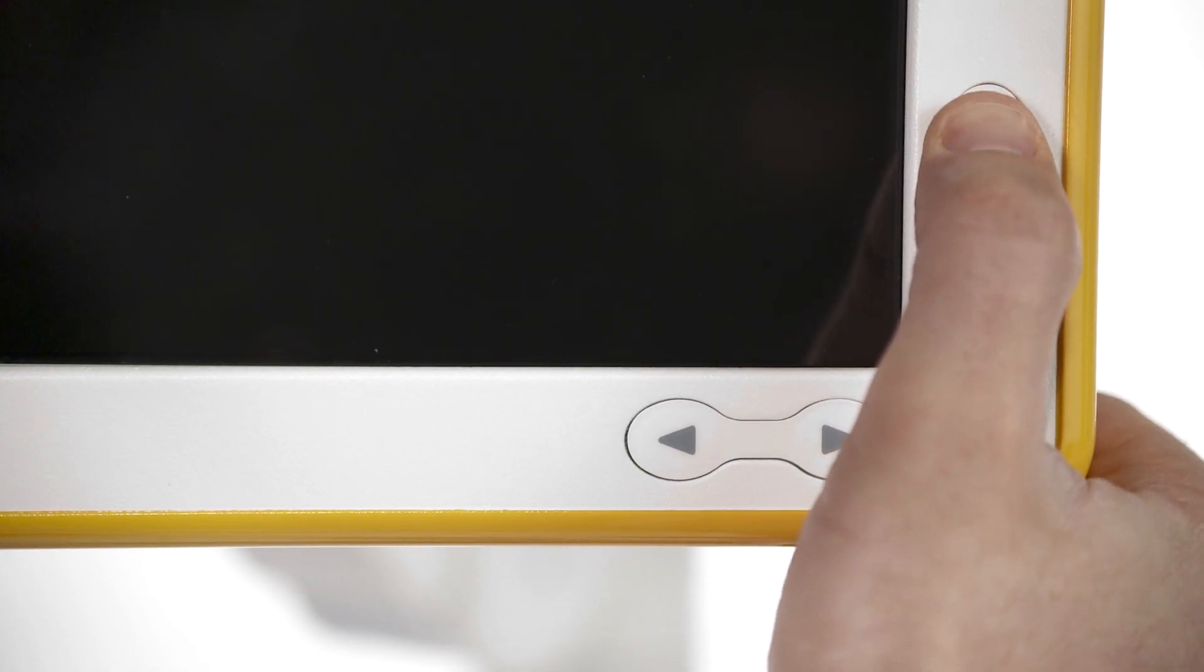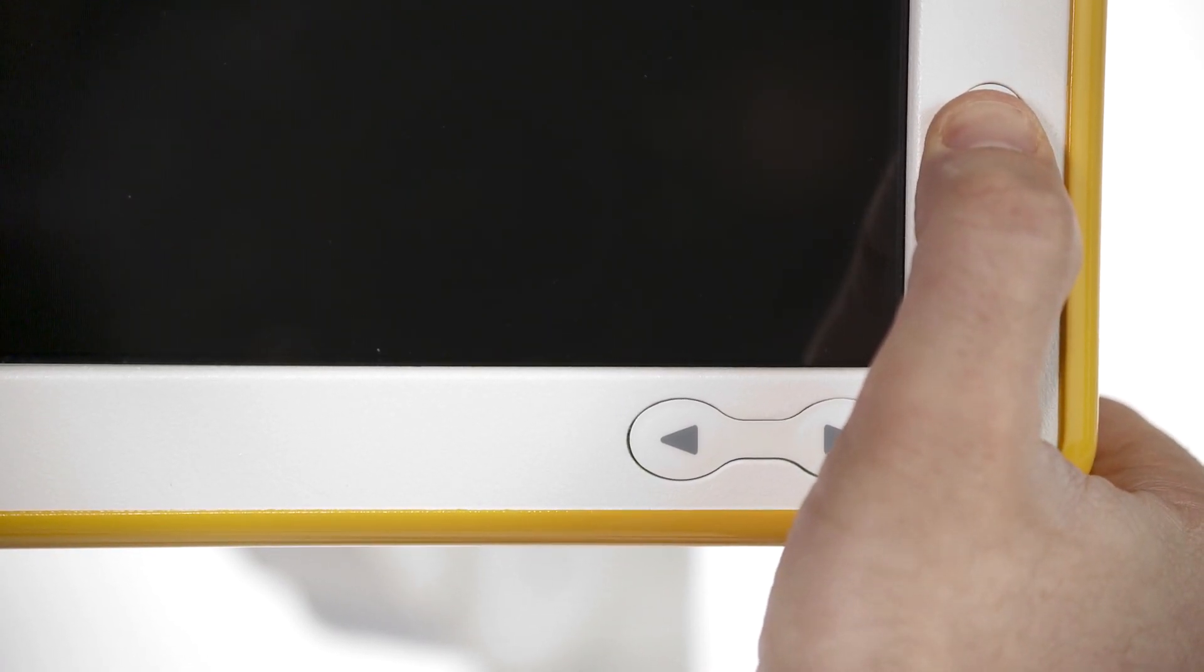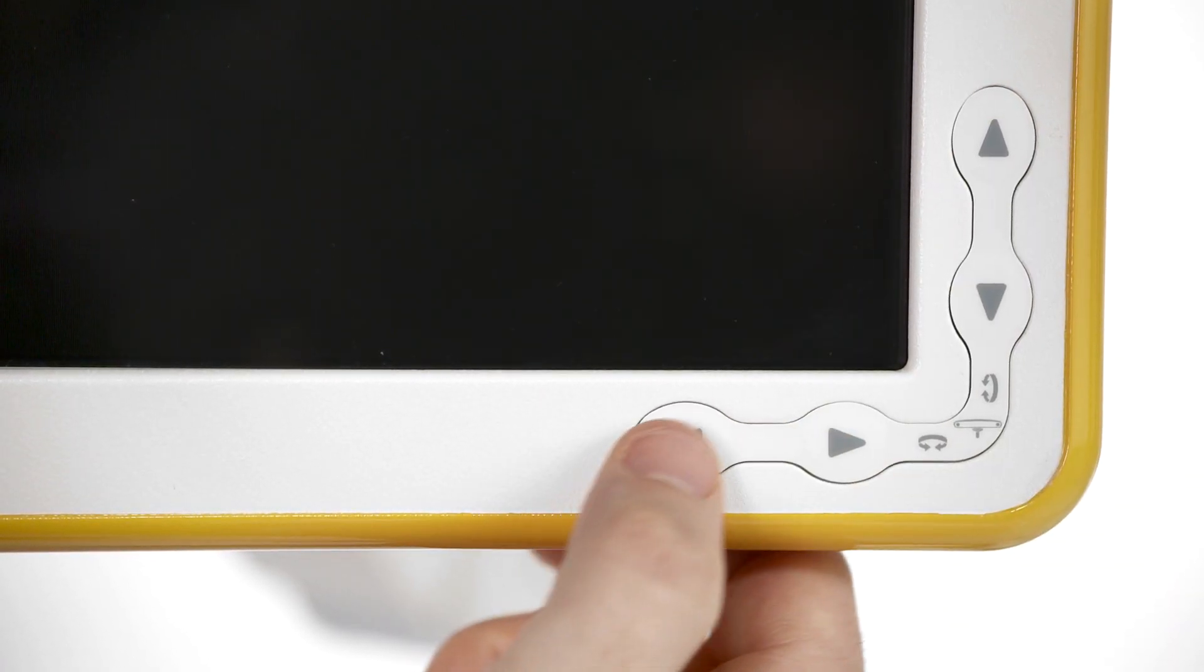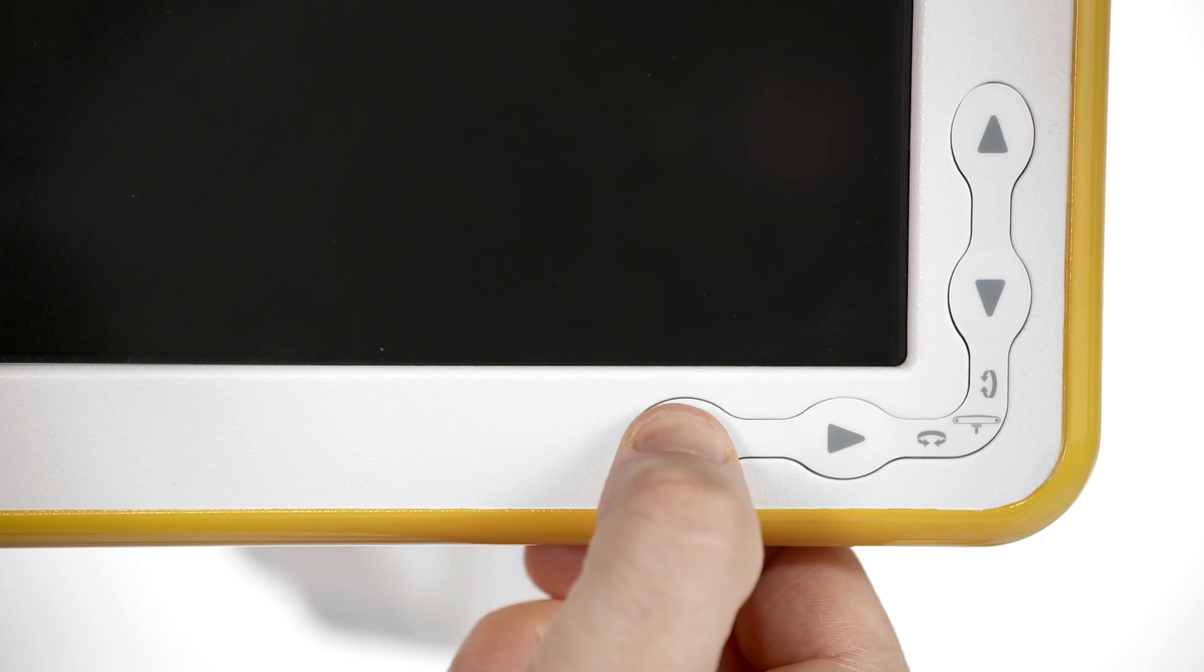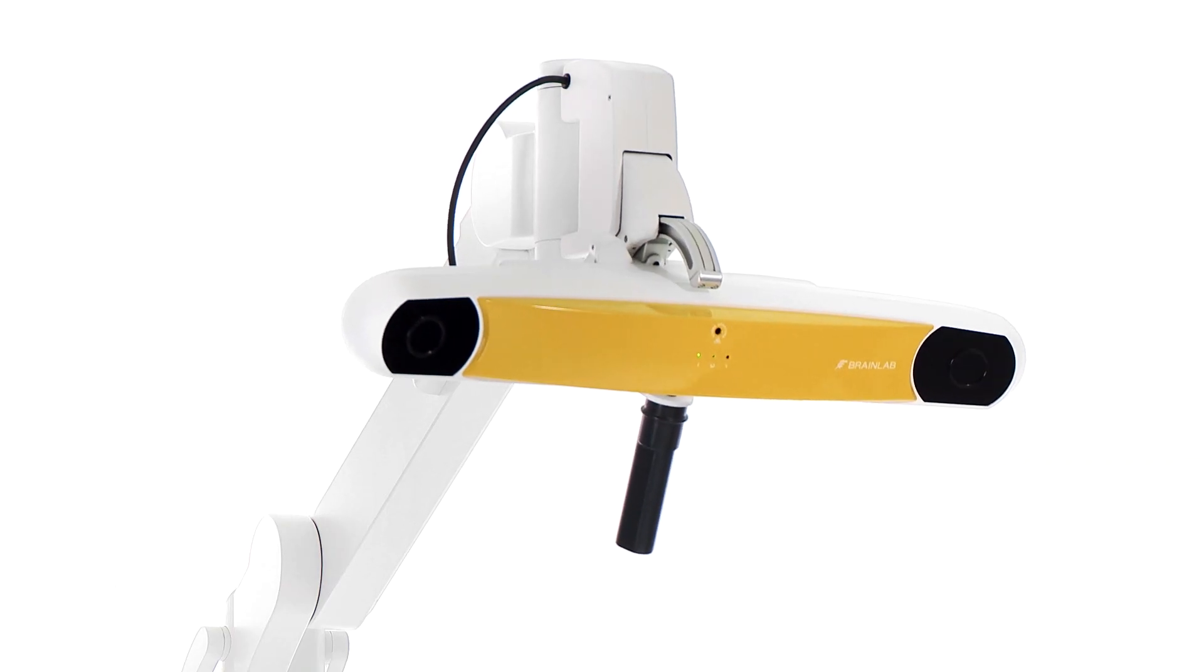Remote controls on each of the monitors allow for positioning when the camera is out of reach.